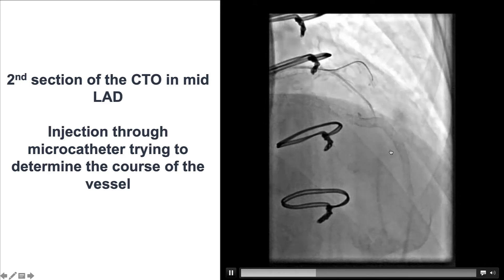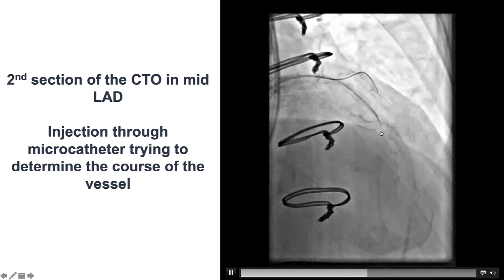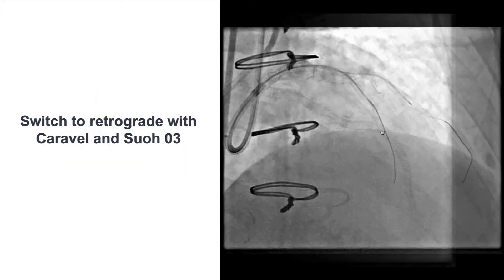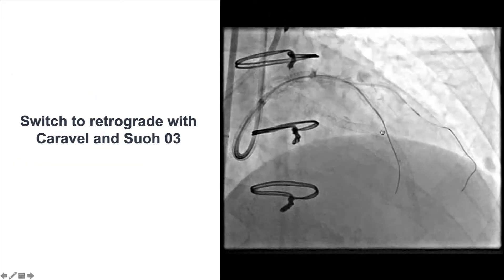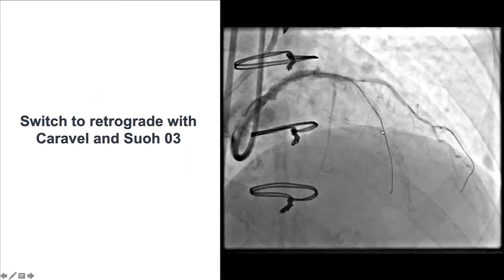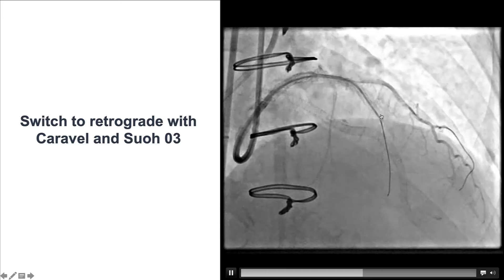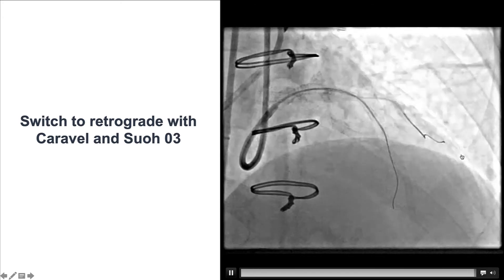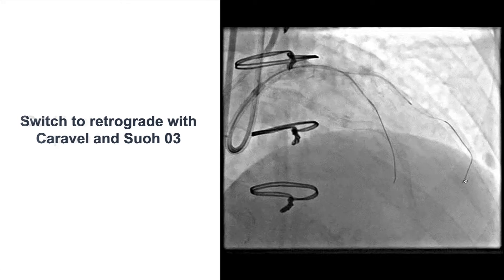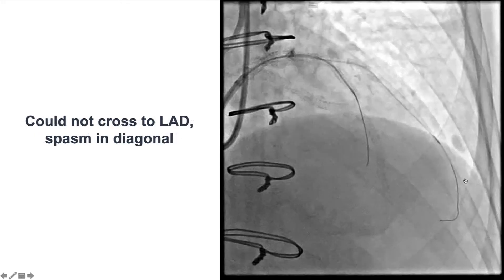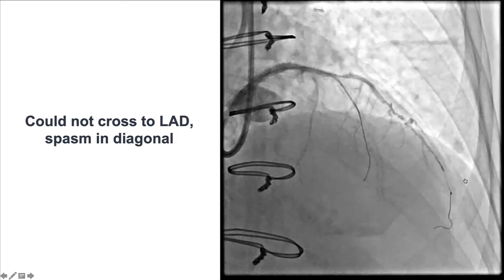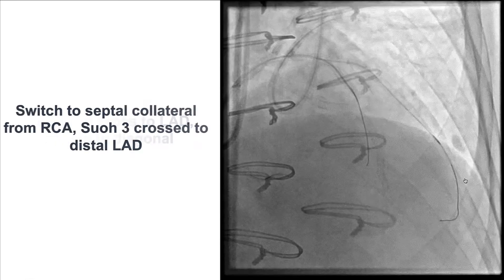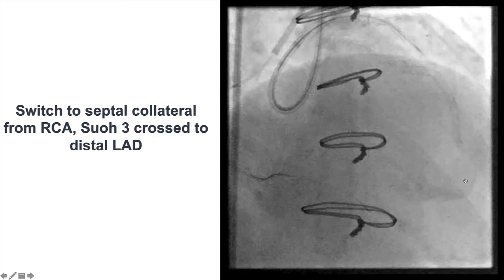As a result, we decided to switch to retrograde crossing. We tried retrograde through the epicardial collateral using a SUO-03 guide wire, but we were unable to cross and developed significant spasm in the collateral, so we abandoned that option.